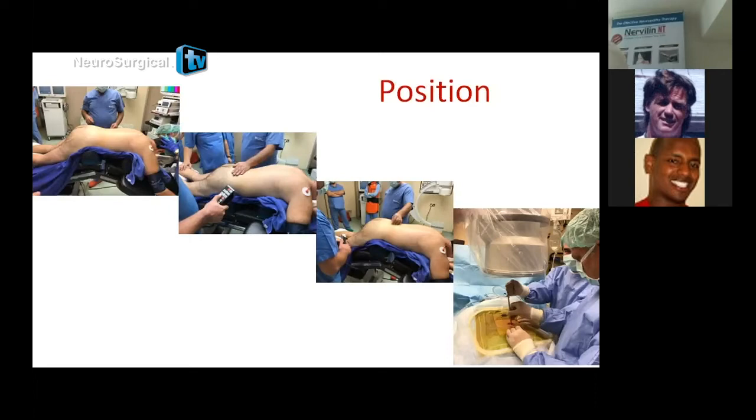If it is not tight, it's very hard to cut the ligamentum flavum with the endoscope. So you put your hand here and tell the assistant, bend, bend, bend. When you're satisfied, you can begin the operation.